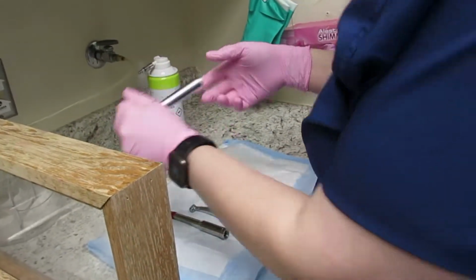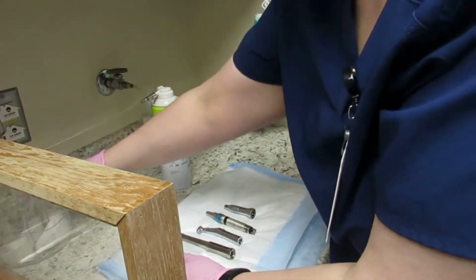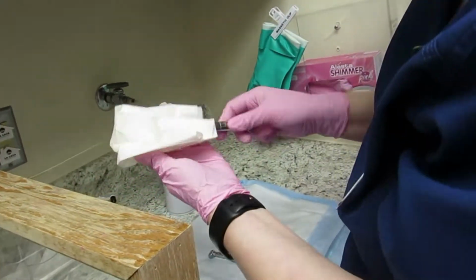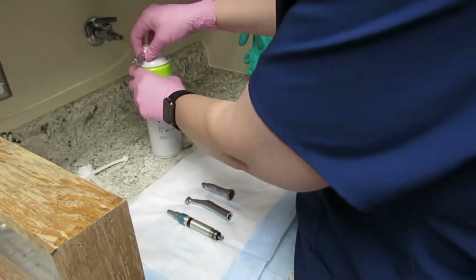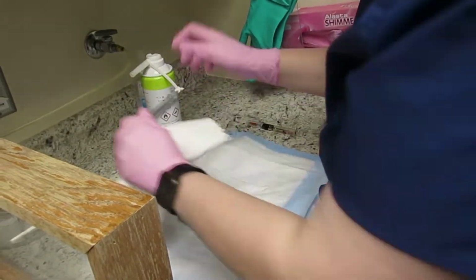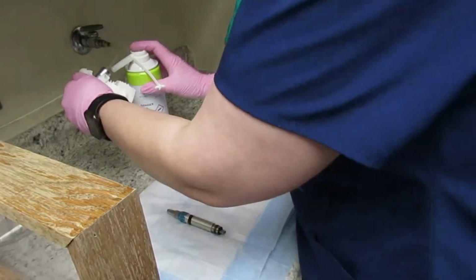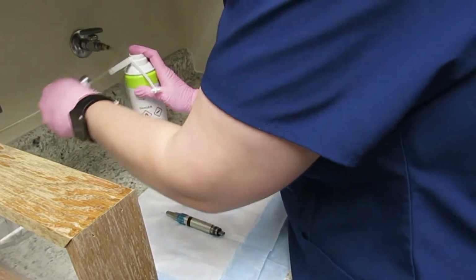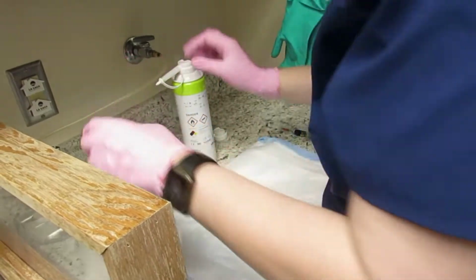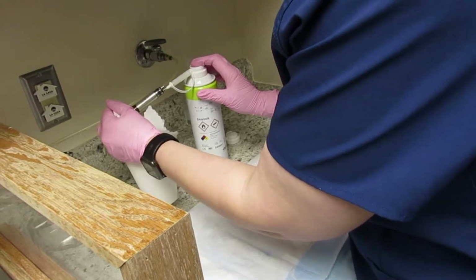We are going to demonstrate the lubrication process using the spray first. You want to shake the can before using it. Then choose the correct lubricant adapter for the handpiece being used. Keep the tip of the handpiece pointing down and use a paper towel to cover the tip and spray for 1 quick second. Then place all the handpieces in an upside down position for a minimum of 2 hours in a holding container.